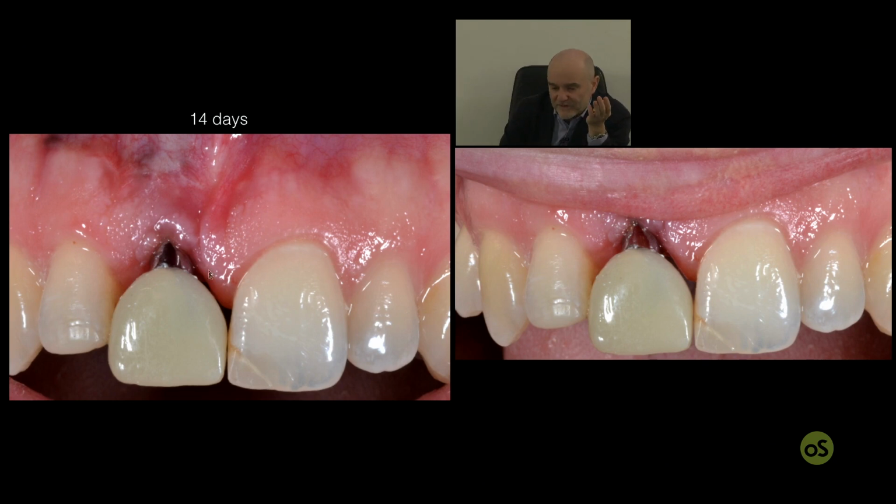And also, the interdental soft tissue is changing completely its shape from a triangular to a more trapezoidal shape because it's filling this area. But don't believe that 2 weeks is enough, even if you see some improvement. This area must be used as anatomic papilla to be desepithelialized intrasurgically, so it must be connective tissue that is as dense and as mature as possible.